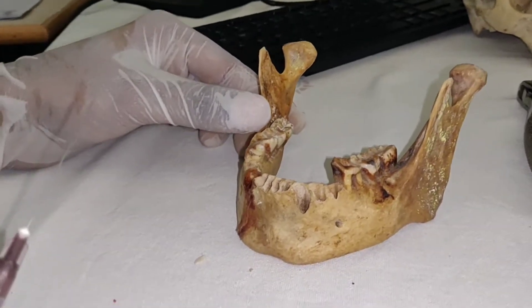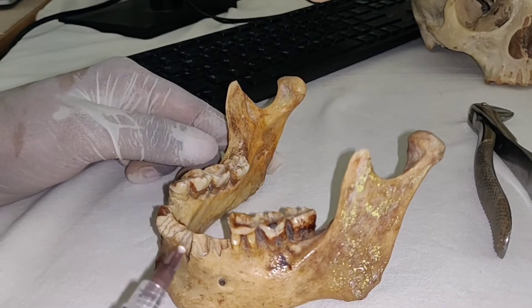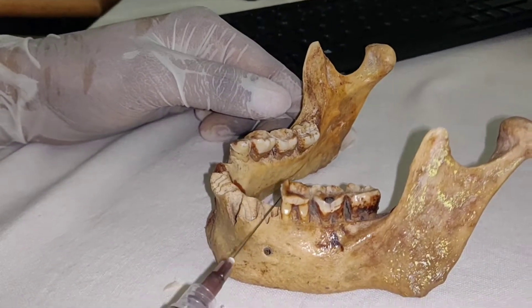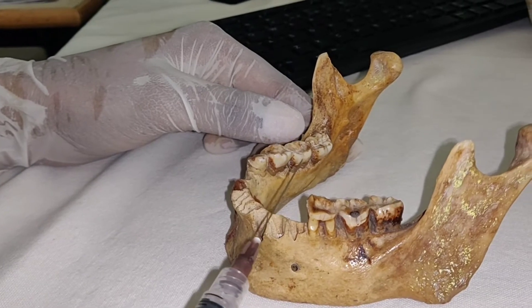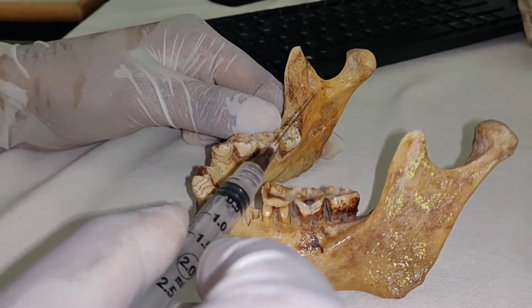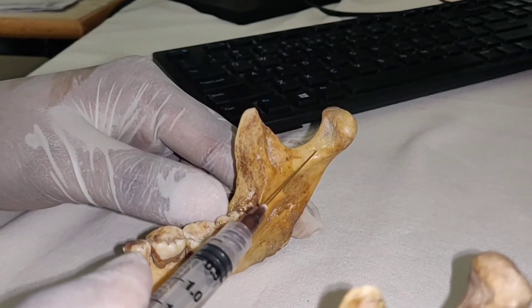Inferior alveolar nerve block is one of the most commonly used nerve block techniques in dental clinics. The indication for this block is extraction of multiple teeth or any other dental procedures involving multiple teeth.